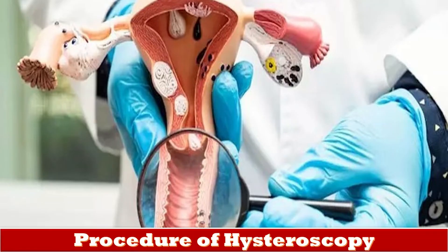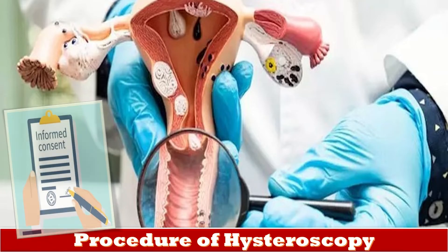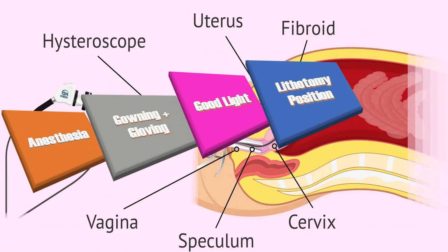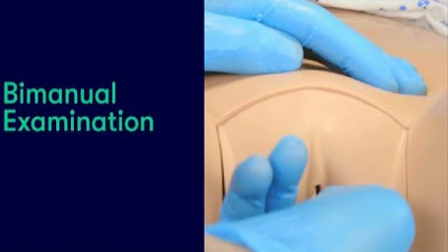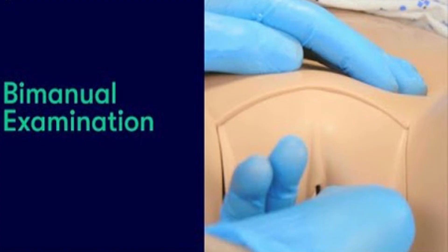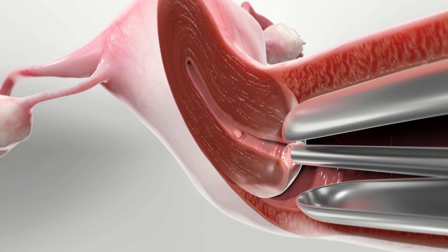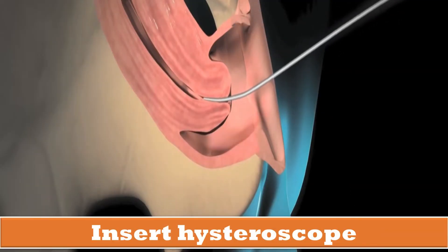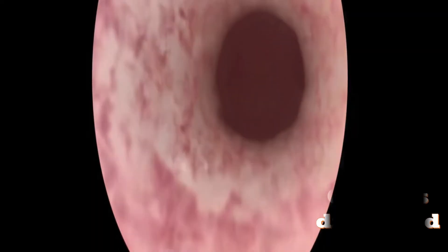After explaining the whole procedure and its complications to the patient and her attendants, informed consent is obtained. After anesthesia, gowning and gloving in good light, the patient is placed in lithotomy position and draped. The bladder is emptied and a pelvic examination is performed to determine size and position of the uterus. The posterior vaginal wall is retracted with a speculum and the anterior lip of the cervix is held with a vulsellum. The hysteroscope is then inserted into the uterine cavity through the cervical canal without cervical dilatation.